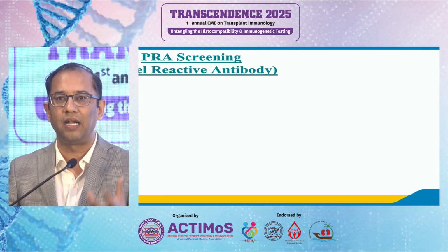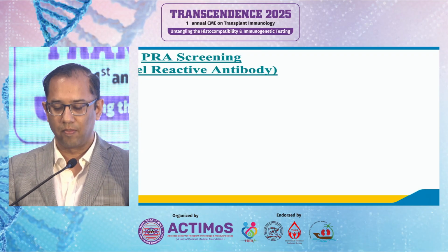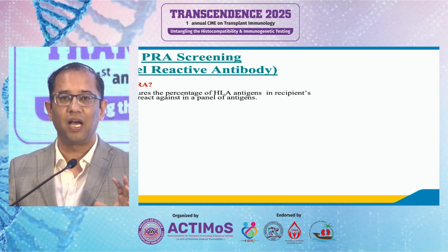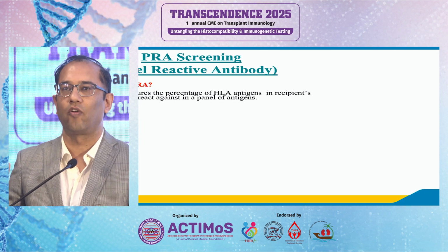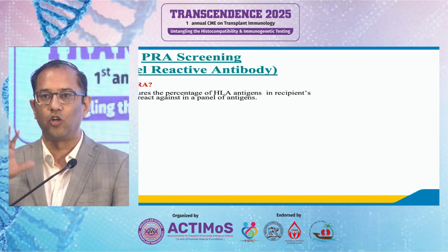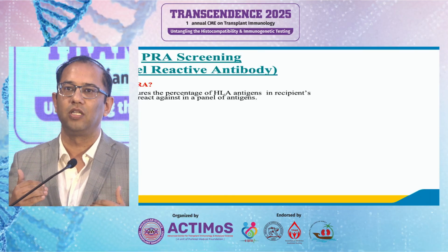So PRA or antibody screen is a basic test that we can all do. It is a test that I heavily rely on. And what is PRA? It basically measures the percentage of HLA antigens against which the recipient has antibodies, using a panel of antigens. Suppose you have a panel of 40 antigens from donors, and how many of them come positive will determine the PRA.